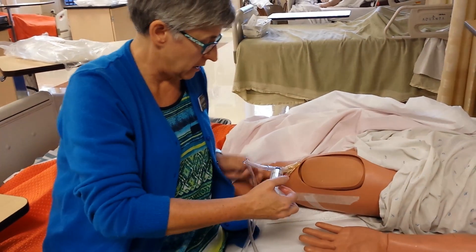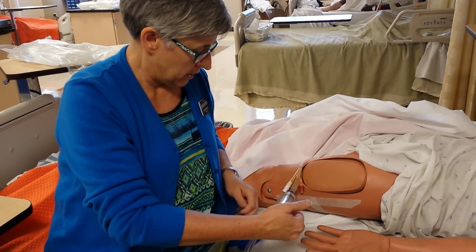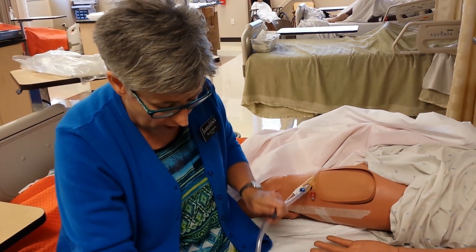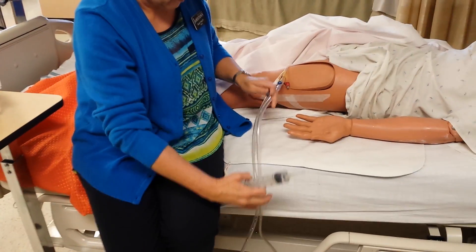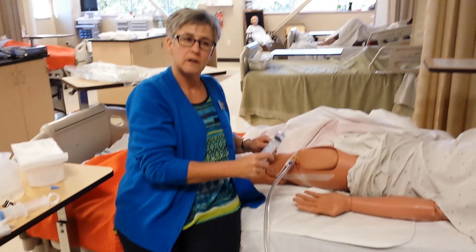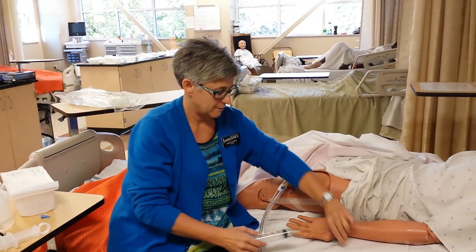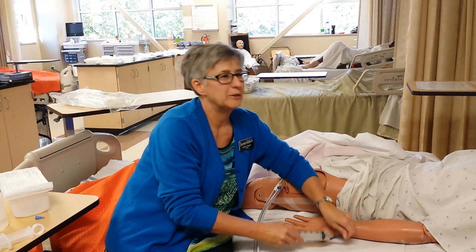After I push my fluid in — pretend I'm pushing my fluid in here forcefully — I'm opening up my drainage to let it go out, but not until after I push my fluid in. Now the other option — that's closed. Never recap needles, remember, you always have to do it like that.